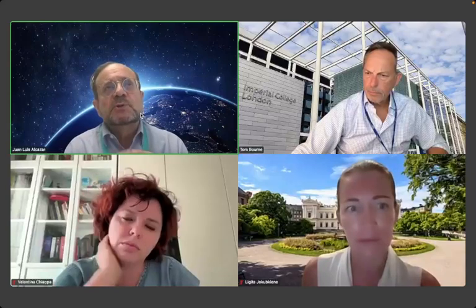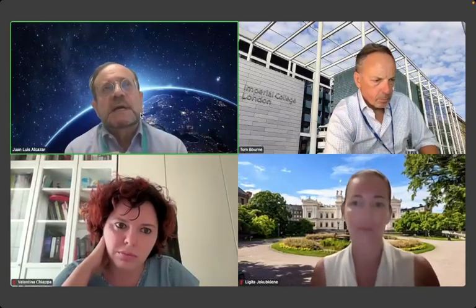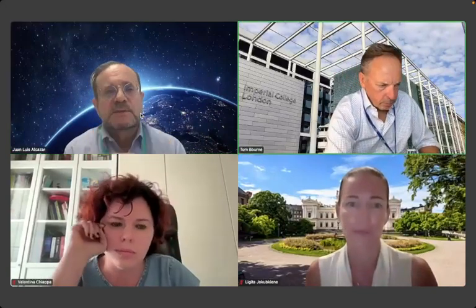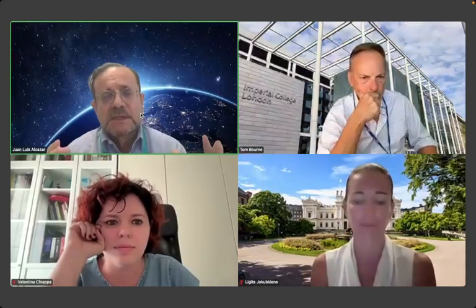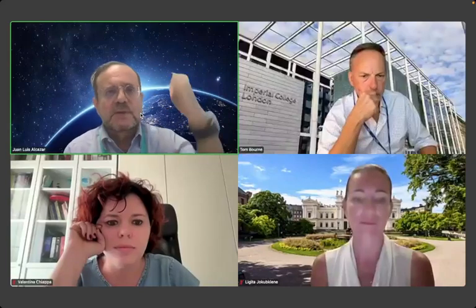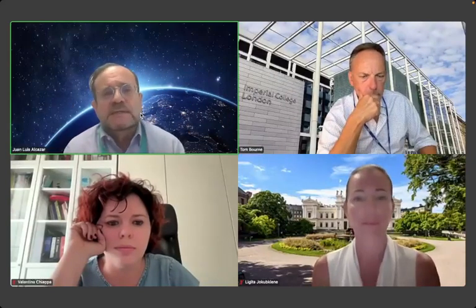Yeah, I would say that if you are able to identify the vaginal wall, which is gray, immediately behind it is the uterosacral ligament, white, in most of the ladies. So this is very simple: gray, white, gray, white. So just to realize that you can identify this on the parasagittal view and in the transverse view. That could be very simple, but could be very helpful.